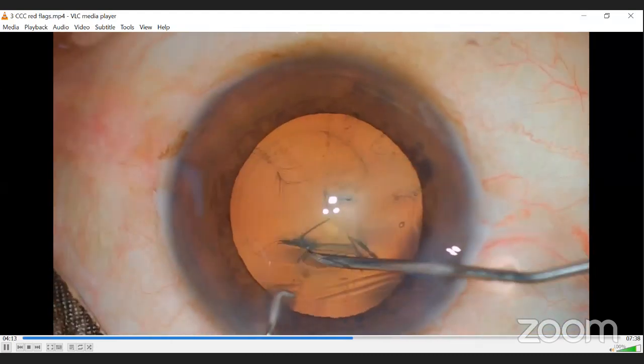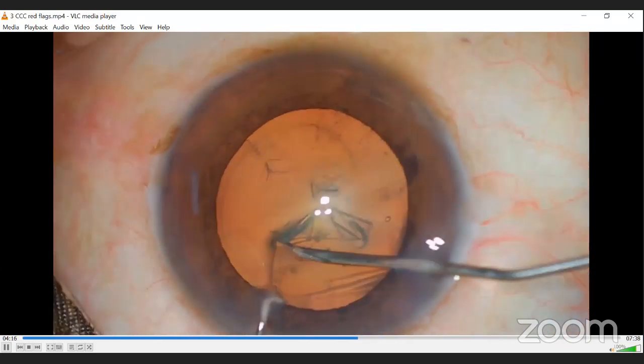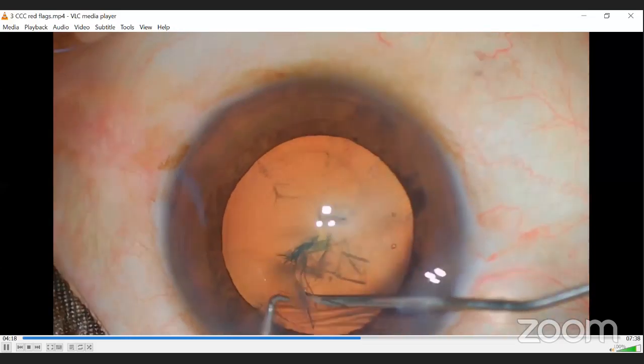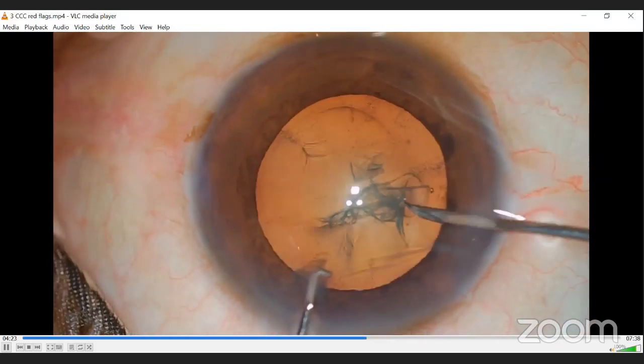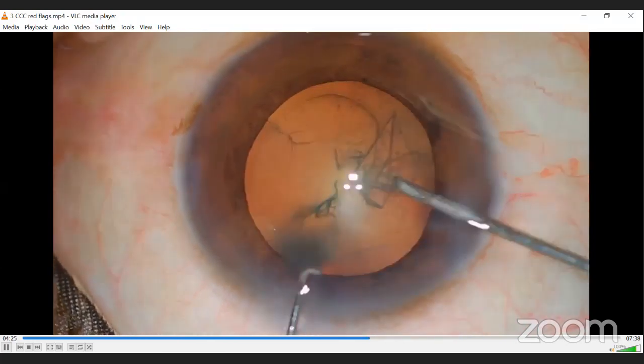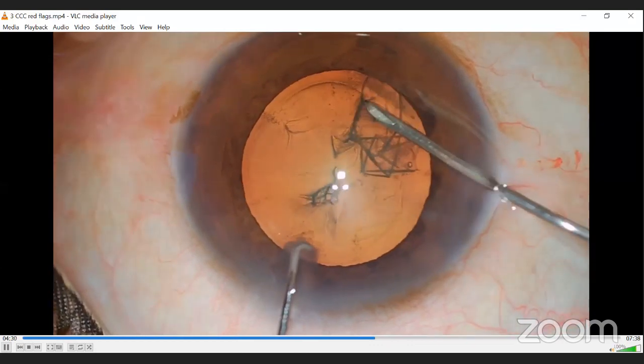Watch here, the surgeon is pressing on the posterior lip of the incision. Visco is leaking out a little bit. As you can see, the CCC is trying to become bigger and bigger on its own. The surgeon is experienced, so he pulls it back. But again, he is not replenishing the antechamber with visco.